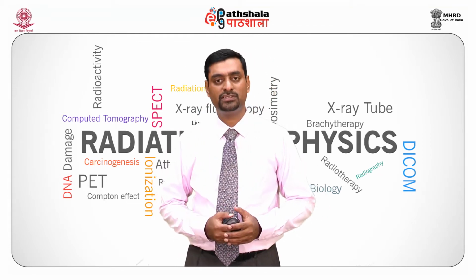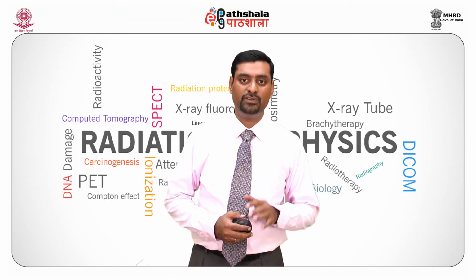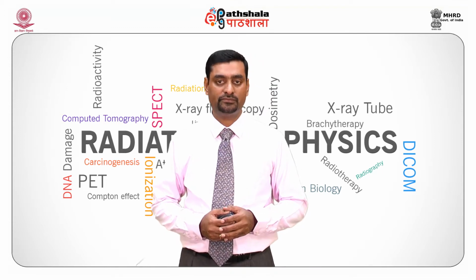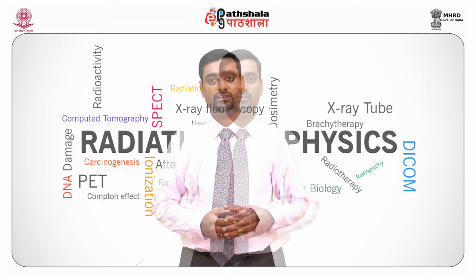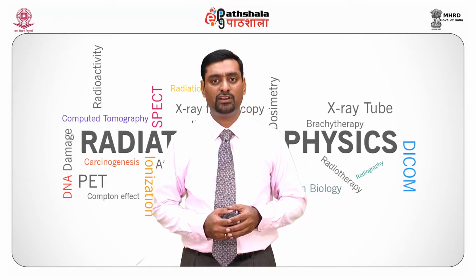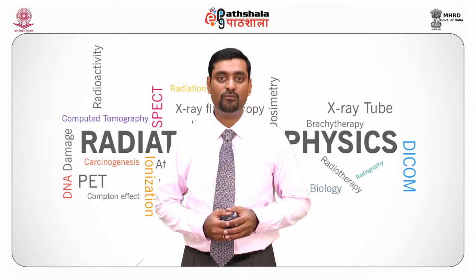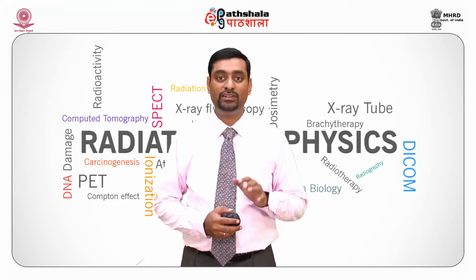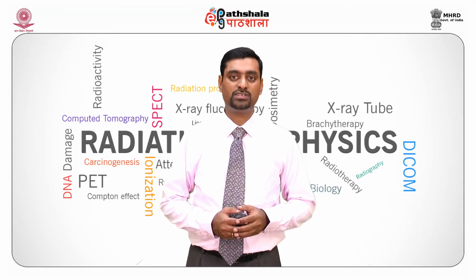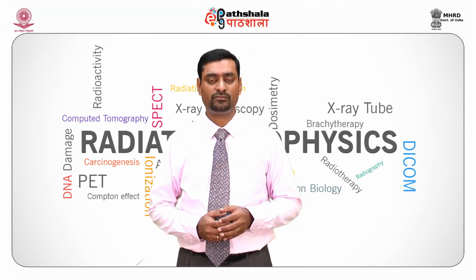So, what happens in this principle? When X-rays hit on a film, the film gets exposed to light through an intensifying screen, or X-rays themselves can produce an image. The X-ray film has certain chemical compounds which undergo subtle structural changes to form an invisible image. When the exposed film is processed using chemicals, the invisible image becomes a visible image.